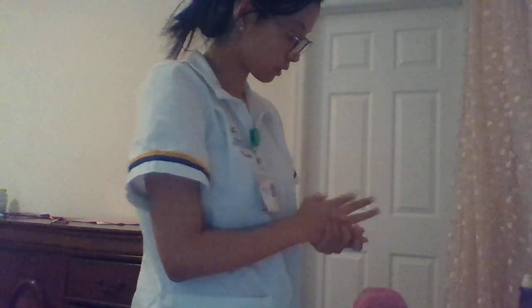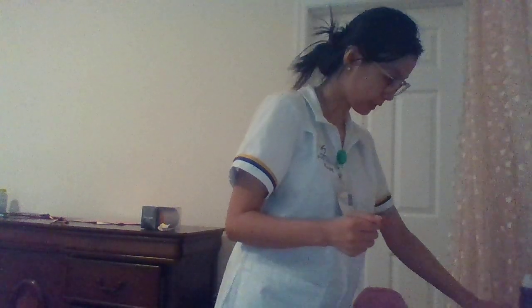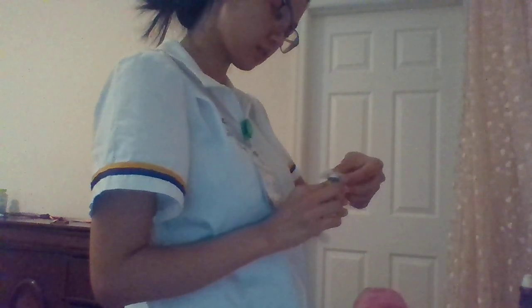I'm going to wash my hands again, and I check the patient is allergic to penicillin, and also check the armband, and I am going to clean my gloves before I withdraw the medication for 30 seconds, and make sure to clean it really well.